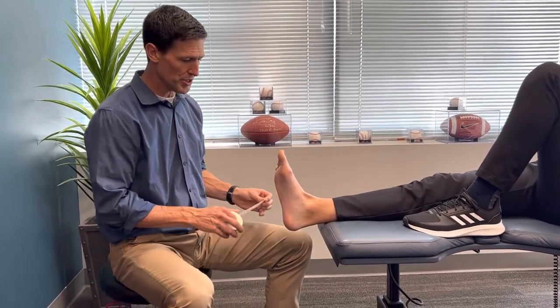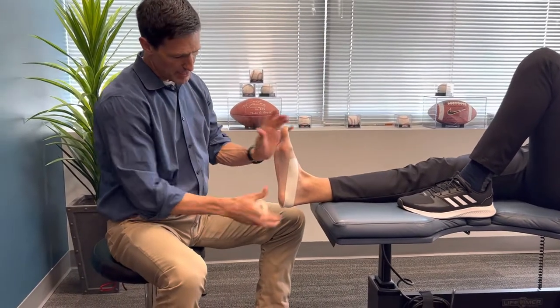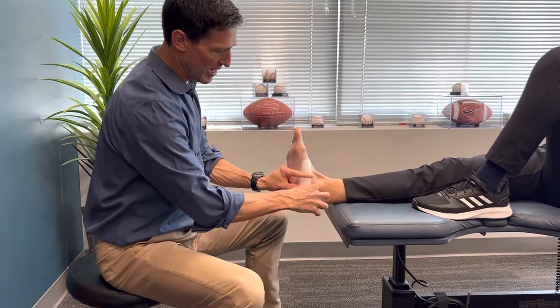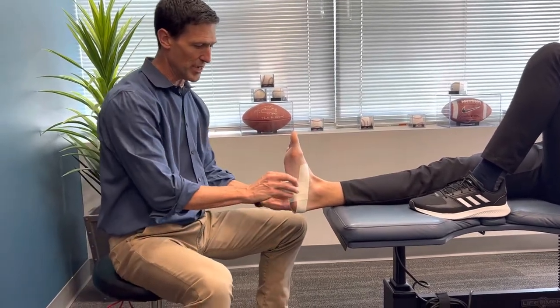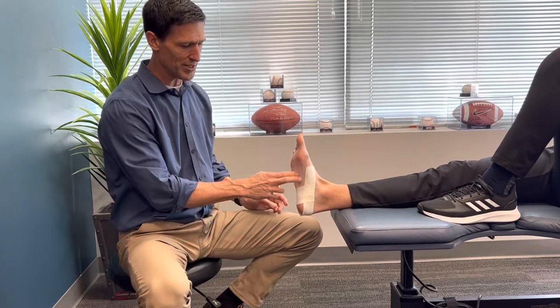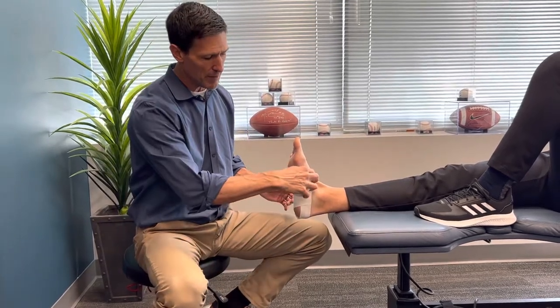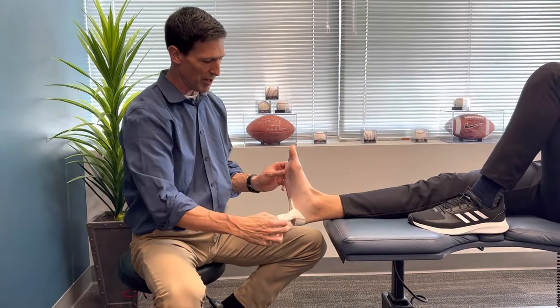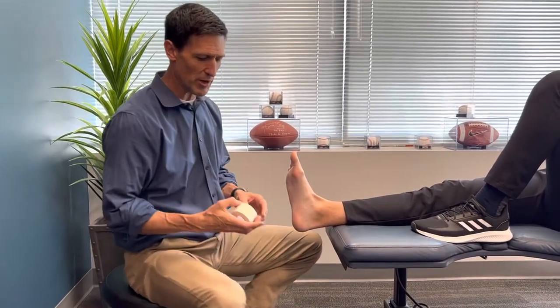I'm seeing a lot of patients with plantar fascia pain. If you've been taught the low dye taping technique — essentially creating an anchor on either side and then taping across — I searched 'best plantar fascia taping technique' and saw a lot of that. The low dye technique is terrible. It works okay and supports the plantar fascia slightly and gives more proprioceptive sense to our brain, but it doesn't work in replacing or even truly supporting the plantar fascia. There's a better technique.